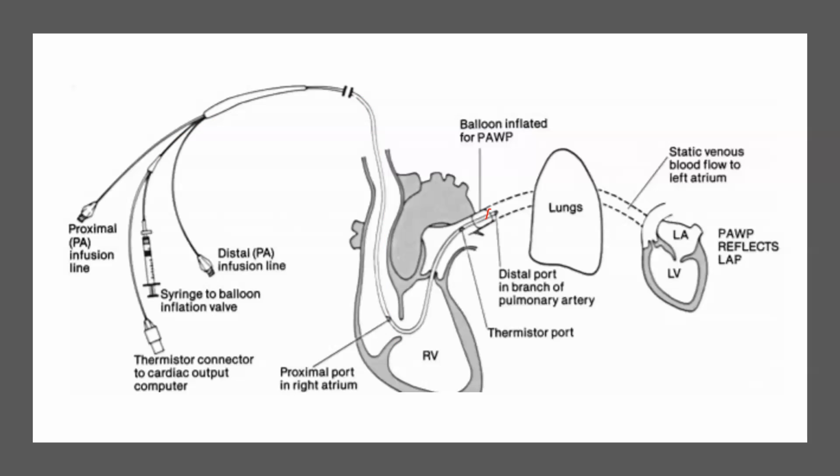When we inflate the balloon, we are obtaining what is known as a capillary wedge pressure, also known as an occlusive pressure, which gives an indirect assessment of the left-sided filling pressures.